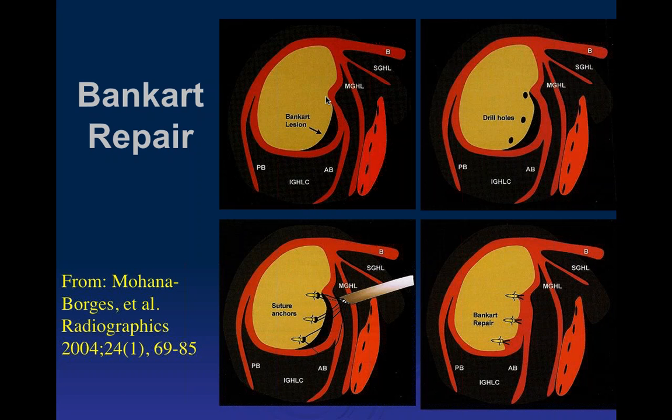Well, one thing, it's easier to do it arthroscopically than to do it the regular old-fashioned way. Because it's very difficult to get to that area without having suture anchors. But not every condition of the shoulder works with the Bankart repair. You have to go by what you find in terms of pathology. Sure. But I suspect you're going in that direction now, so I'll wait and see what you say, John.